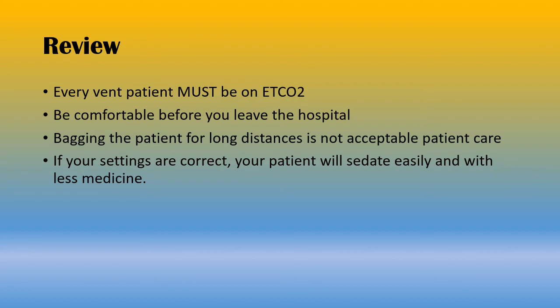If you remember these things and you practice with the ventilator, you're going to be comfortable with vent transports. We're going to do a lot of setting up the vent and playing with it during the hands-on portion of the class. So hopefully this gets you a good broad understanding, and then we'll fine-tune your ventilator skills once we get you in here for the hands-on.